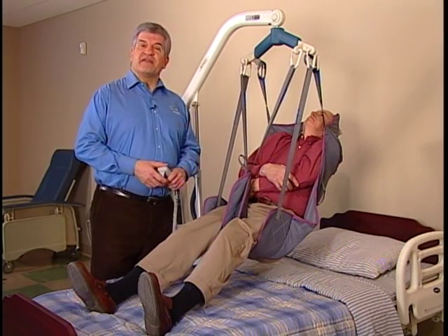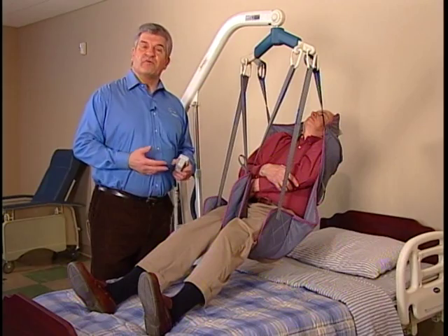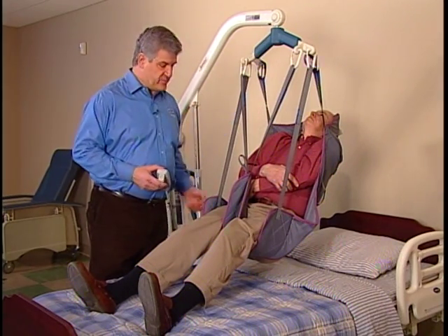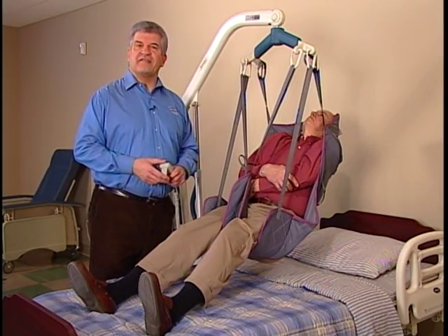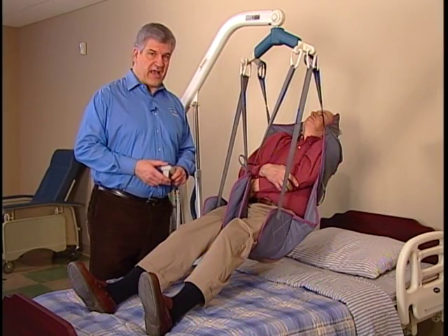They're designed for easy placement and removal, and are well suited for residents where sling removal can be difficult. Support ranges from the head to beneath the thighs. Always check the weight capacity of the lift and sling, and do not exceed the lowest weight capacity of either item.